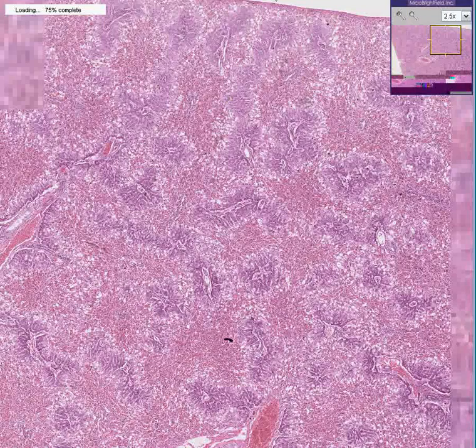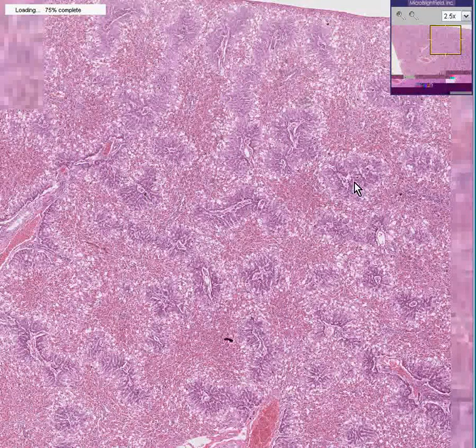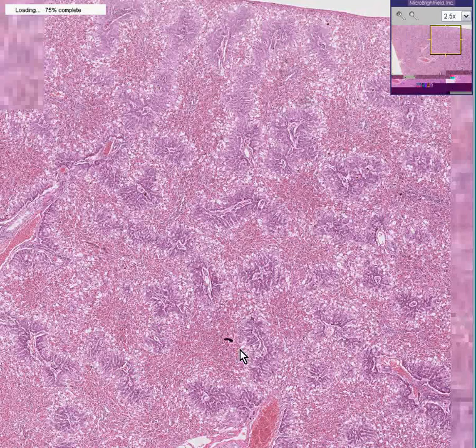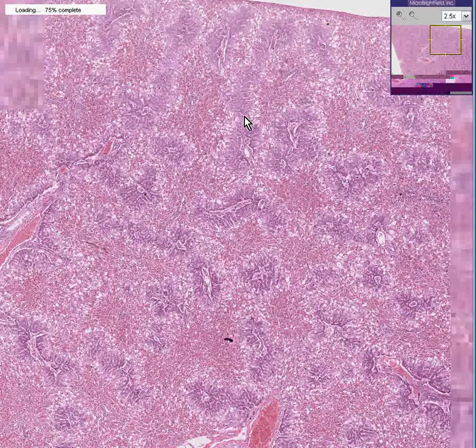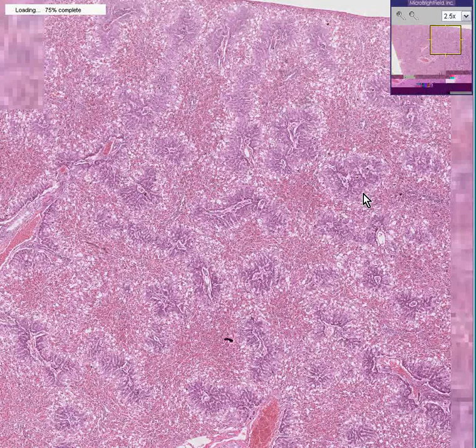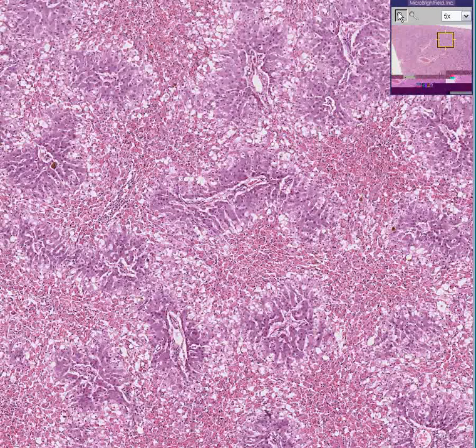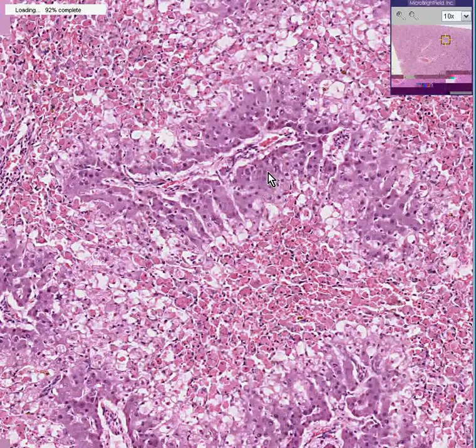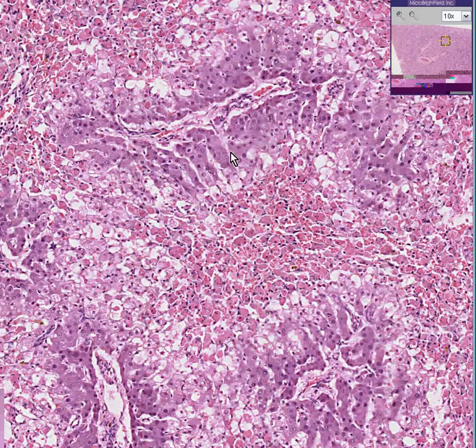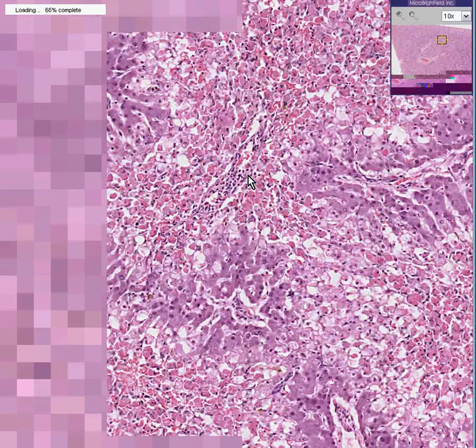Another thing you can see in a very spectacular way that you normally can't is how all of these portal areas generally maintain a spacing in a relatively hexagonal arrangement with respect to each other. This is not randomly thrown into the liver like in nodular cirrhosis — these are still nicely spaced. The architecture is intact, but the one thing you cannot see here is any viable tissue in the central vein areas. The portal areas are preserved; the central areas are not preserved — they're necrotic.